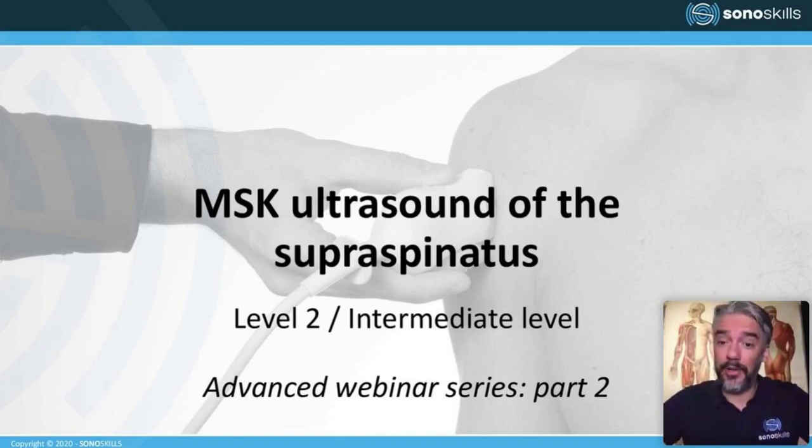But before we start with the third part, the dorsal and inferior part of the shoulder joint, first we need to finish the supraspinatus. Last week we could not discuss the pathology section, so that is what we're going to do first. I hope you could have studied the webinar recording and also the articles we sent you. And let's make a good learning experience of this third part.